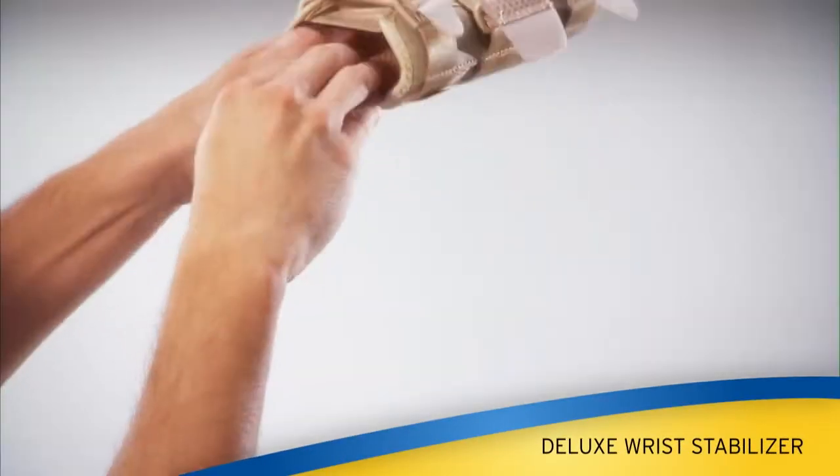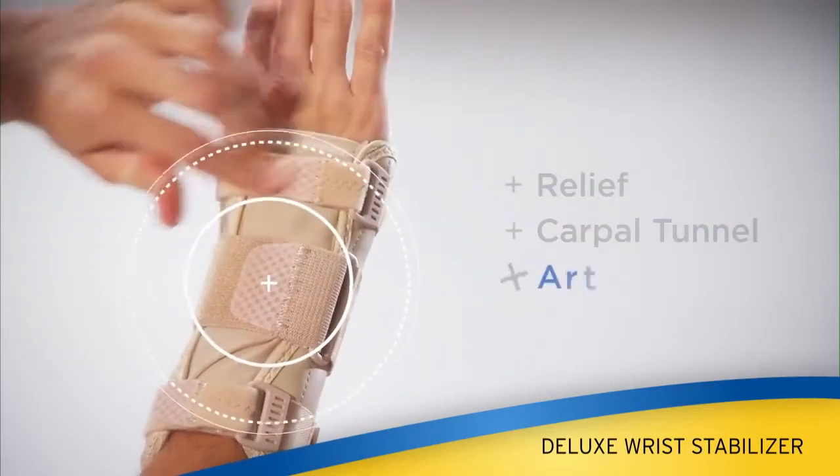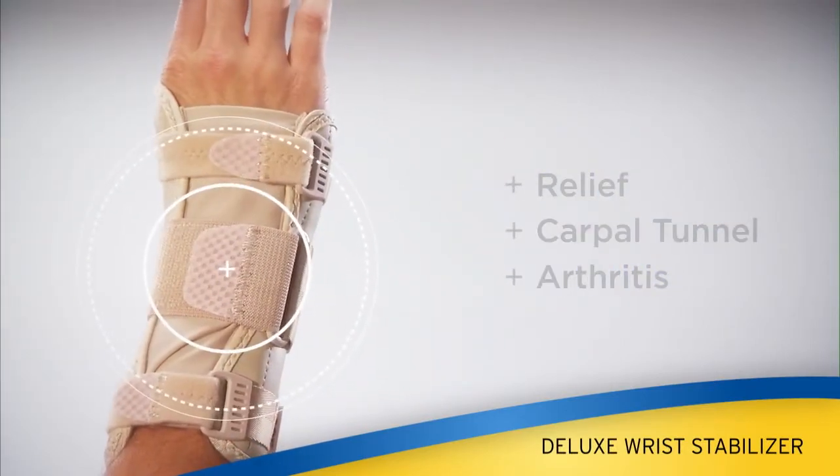The Deluxe Wrist Stabilizer is designed to provide relief from carpal tunnel syndrome, arthritis, or post-cast healing.